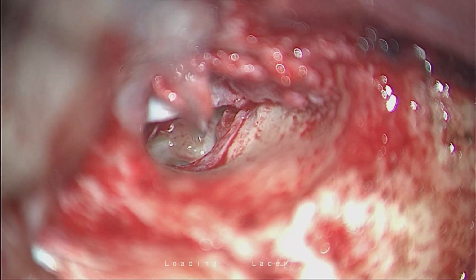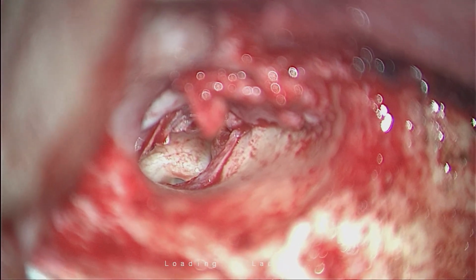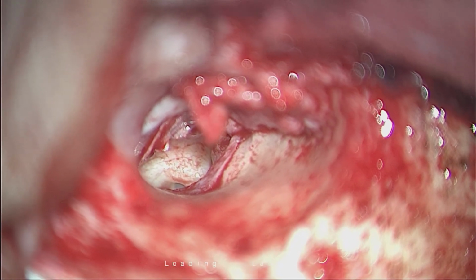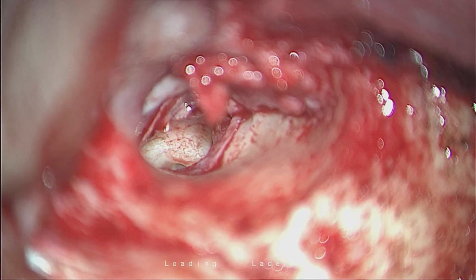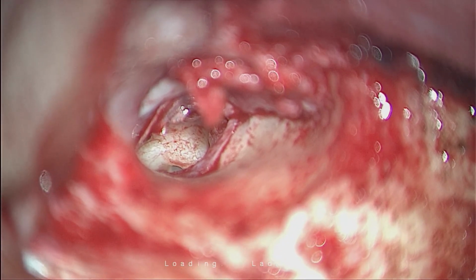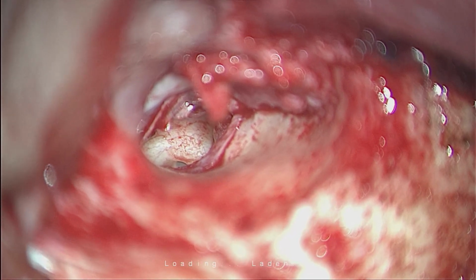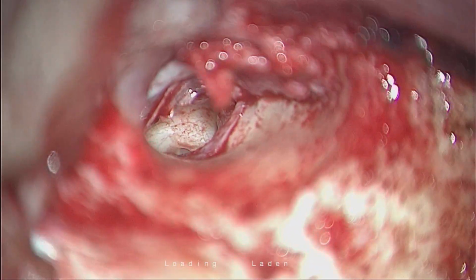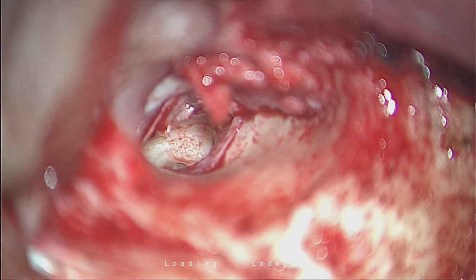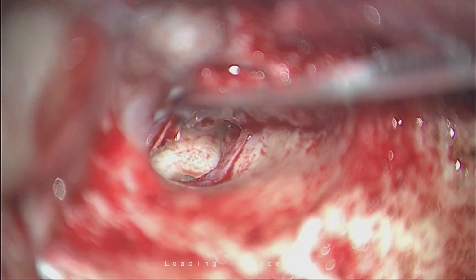Sir, there's a delicate question. They're asking if there's a tear in the flap, what should we do? In the mucosal layer, if there's a tear, what should we do? If the mucosal layer is torn, you can cut the edges again till the level of the tear. You can see there is less mucosa rather than hanging down. So remove the torn part, because this mucosa is the same which is coming from the middle layer, then draping along the walls and then coming underneath the tympanic membrane. You don't bother about that.